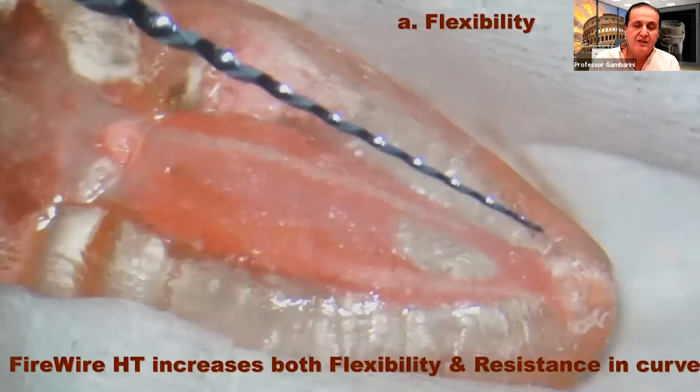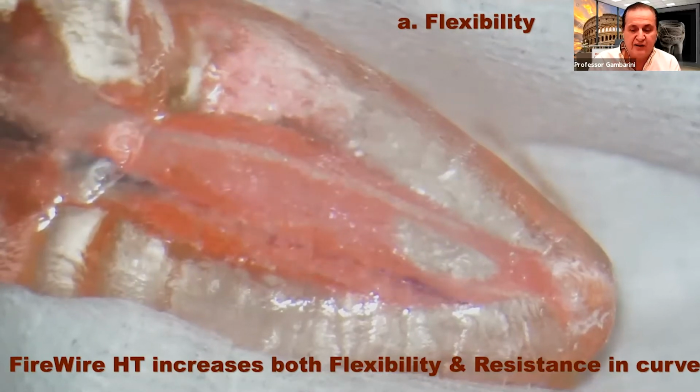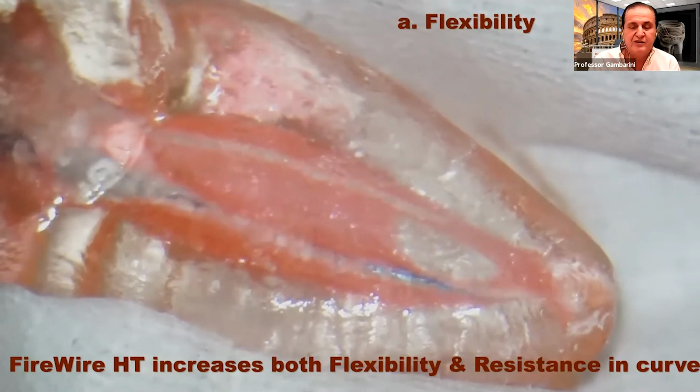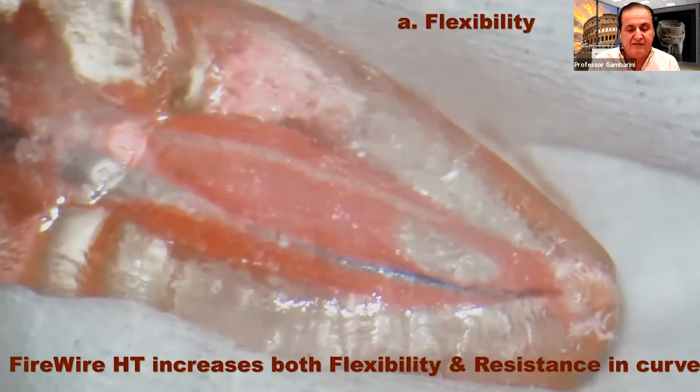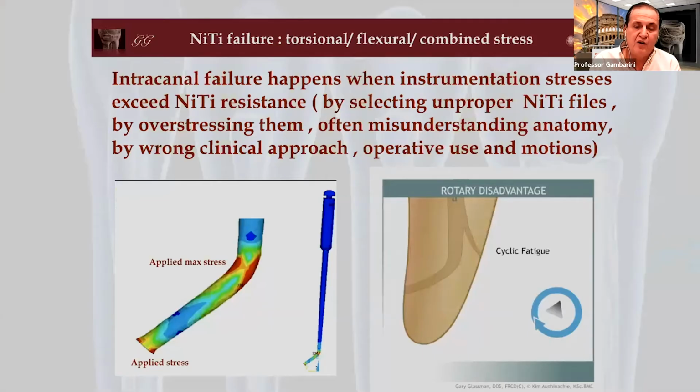So as I told you before, the firewire, the heat treatment, increased flexibility. But luckily, by doing this, because it's restoring the crystal, it is also increasing quite a lot the resistance of this instrument to cyclic fatigue, to bending stress. So we know that intracanal failure happens when instrumentation exceeds the resistance of the file.